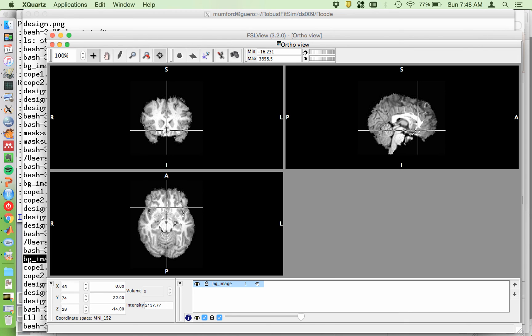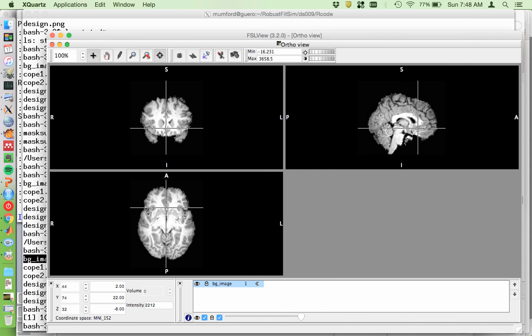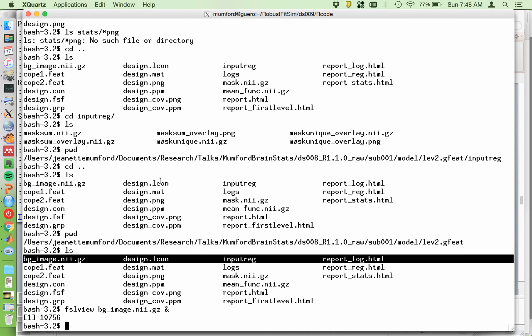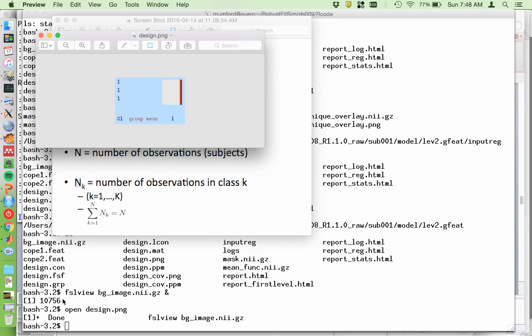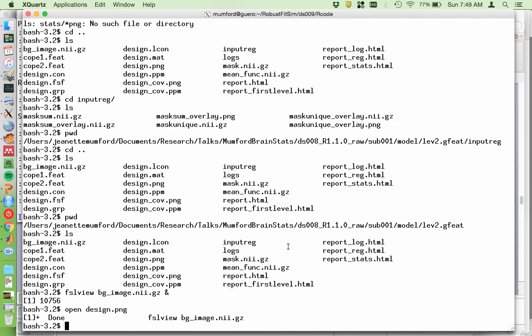I'm kind of assessing the registration while looking at this image. Then you have a selection of these design dot files — these are just the files that were used to create the design matrix. On my Mac, we already know this is just a simple one-sample t-test. So that was the design matrix. And we also have all the design files, the mask file, the mean func image, and the report.html file.